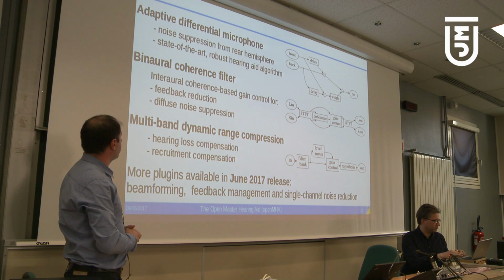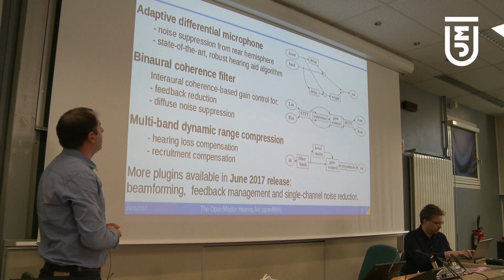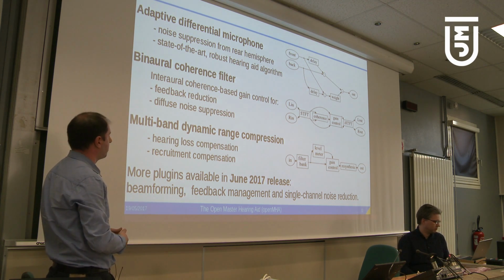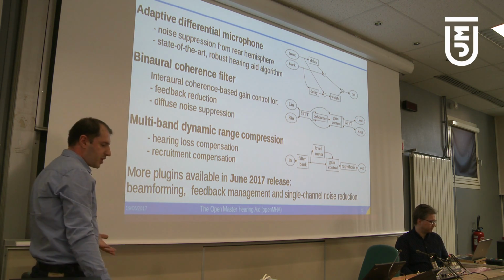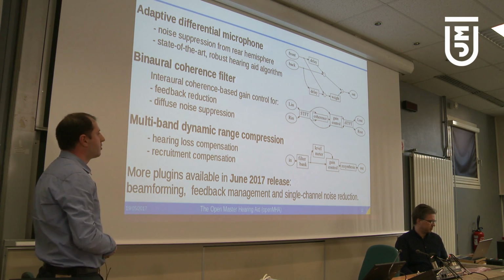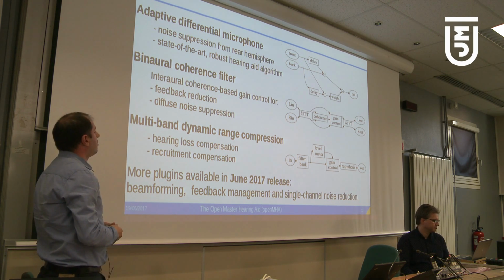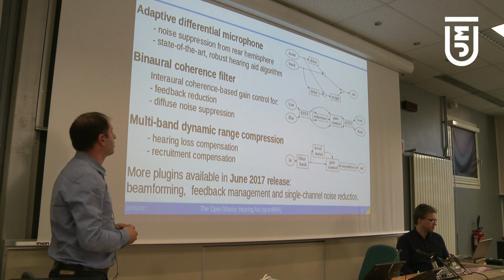Again, before going to the software architecture itself, just to mention a little bit of what these algorithms are and how they can be implemented. As was mentioned before, in cases of hearing impaired persons, the inability to hear soft sounds is not the only issue, but also the intelligibility of the signal in noisy environments. So what's desirable is to have algorithms which can enhance signal-to-noise ratio.